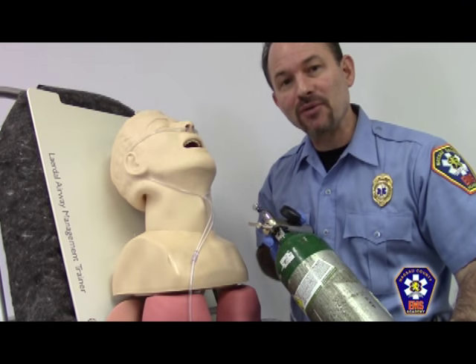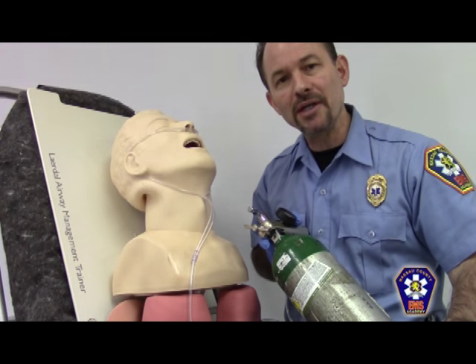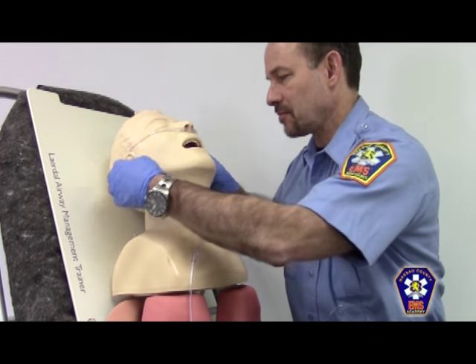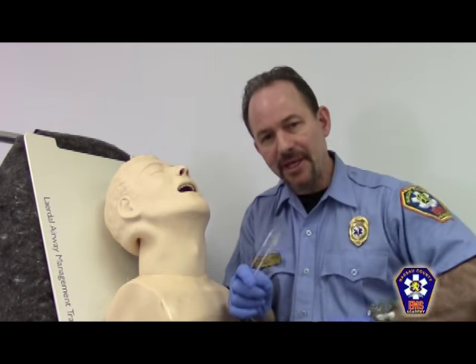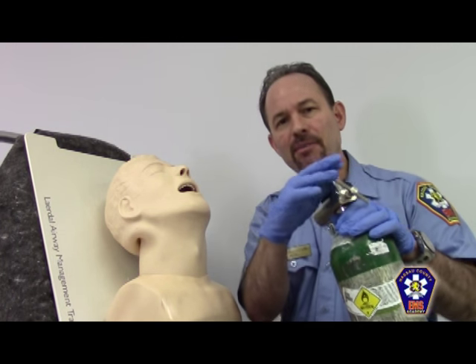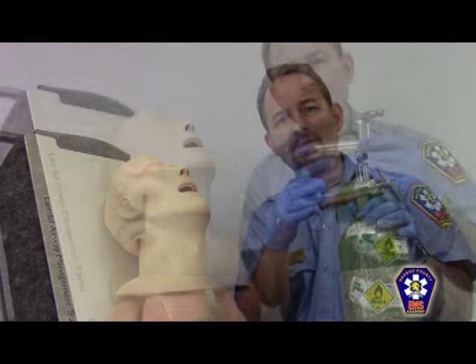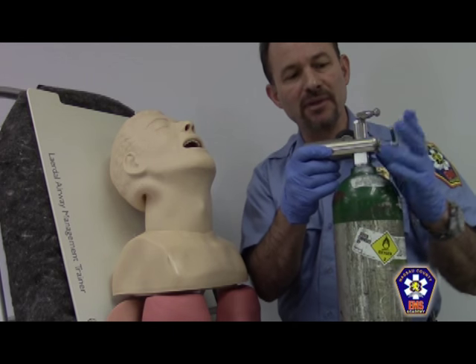Once the medical staff from the hospital requests that you remove the patient from the oxygen delivery system, do so in the opposite order that you applied it. Firstly, remove the patient's mask or nasal cannula. After removing the oxygen delivery system from the patient, you may now turn off the flow valve on the oxygen tank, followed by turning off the oxygen tank itself, and then bleeding whatever oxygen may be left. Once the oxygen has bled out from the regulator, it is now safe to remove the regulator from the tank.